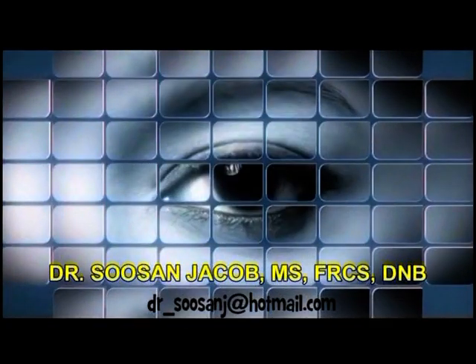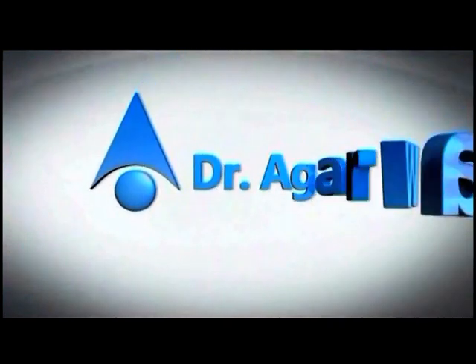Hi everyone, I am Susan Jacob and in this video I am going to demonstrate the divide and conquer technique of Nucleofractus.